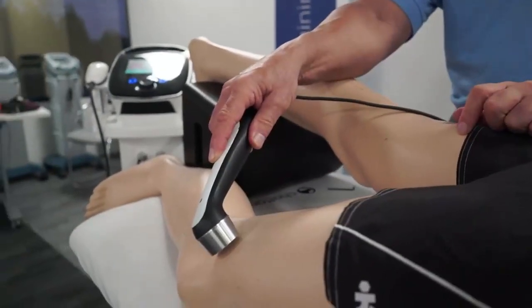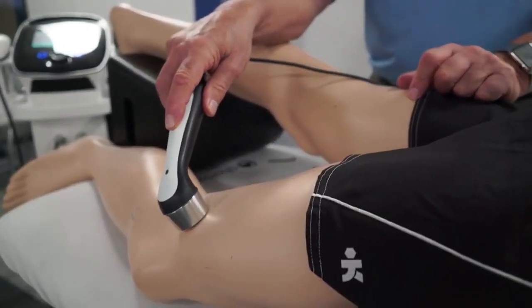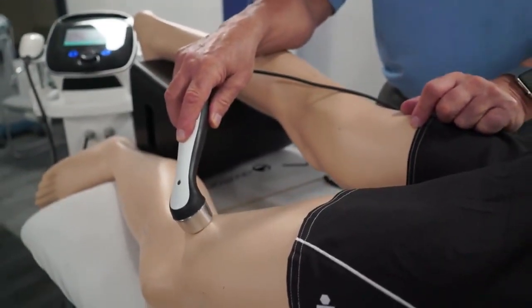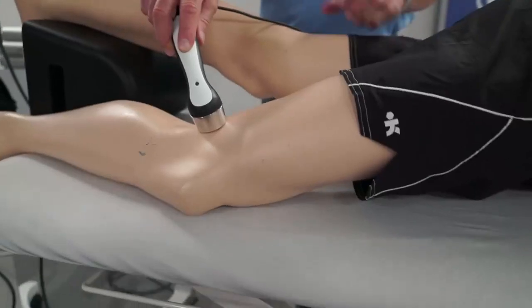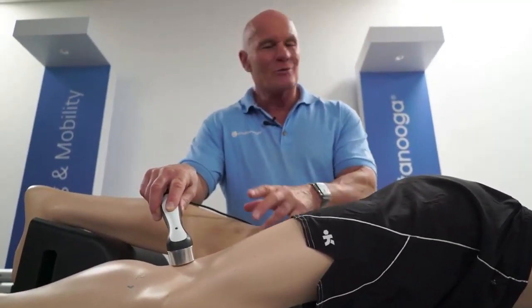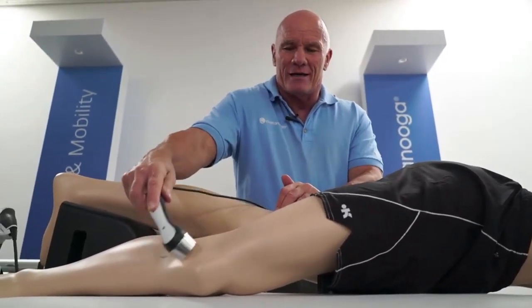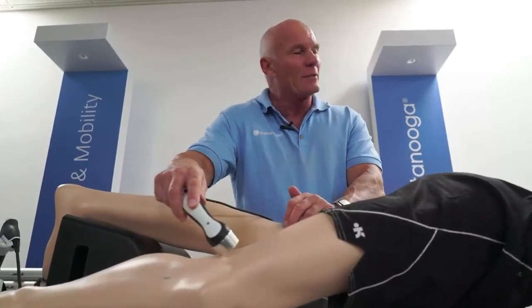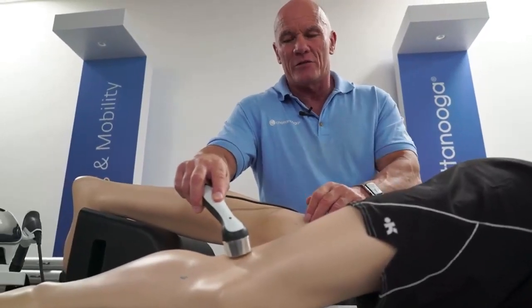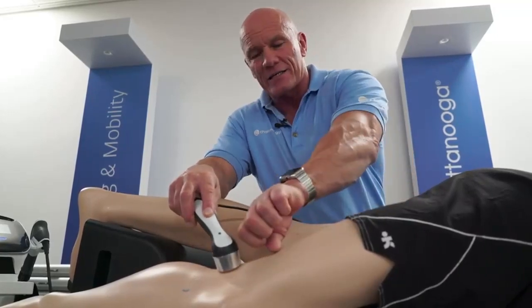And how often have I seen therapists chasing the gel? For me, gel is such an inexpensive part of the treatment, yet we mustn't waste it. It's running down here, so let's go chasing it and scoop it back up here. We're no longer giving the patient treatment. We need to keep this in contact with the skin. If you haven't put enough on, just have some readily to hand and squirt it on and continue your treatment rather than going to chase it.